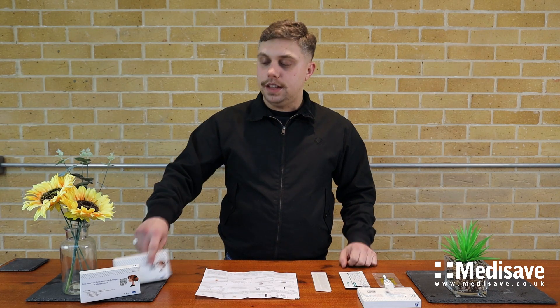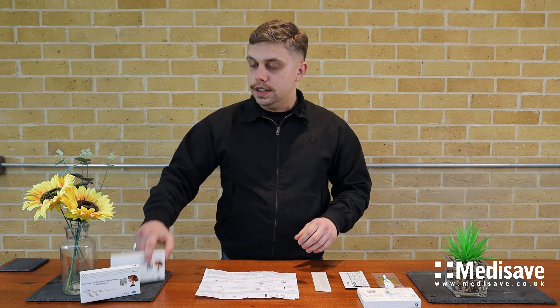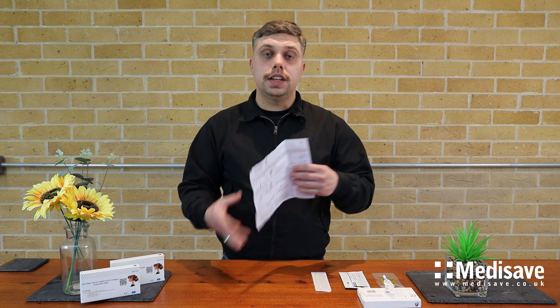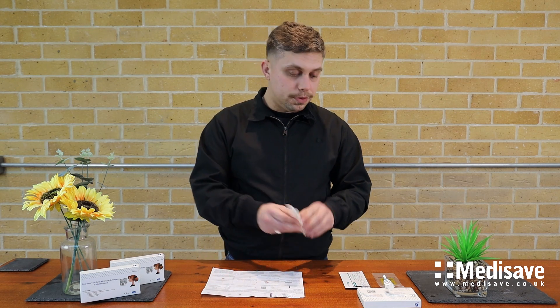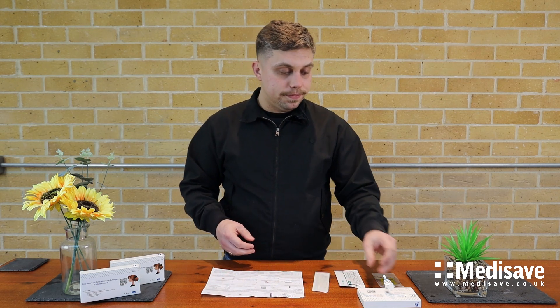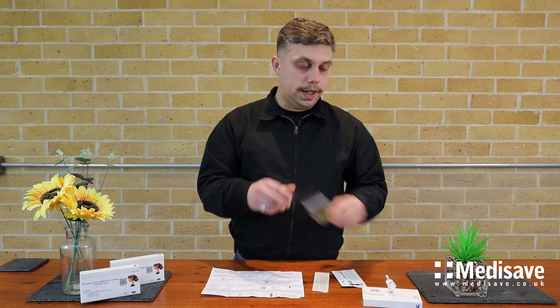Hello, I'm Kerwin from MediSafe and today we're going to be looking at the COVID-19 antigen test. In every test you should get a safety information sheet on how to take the test, as well as a swab sample, test cassette, extraction tube with solution, and safety disposal bag.